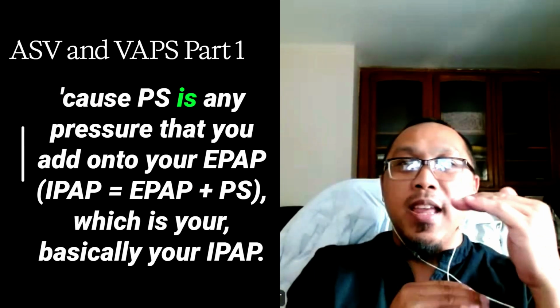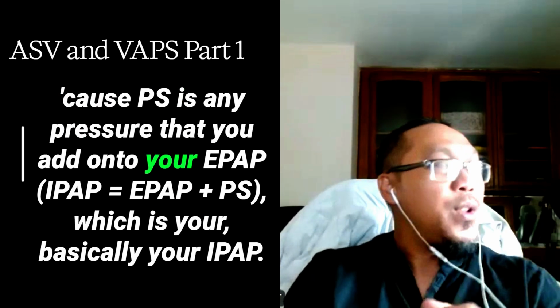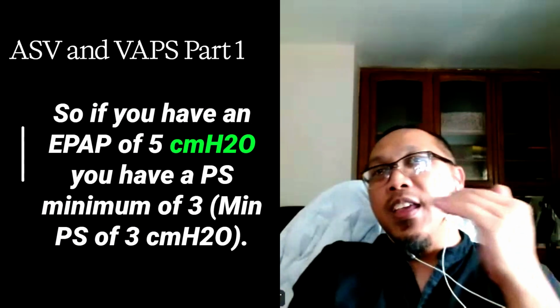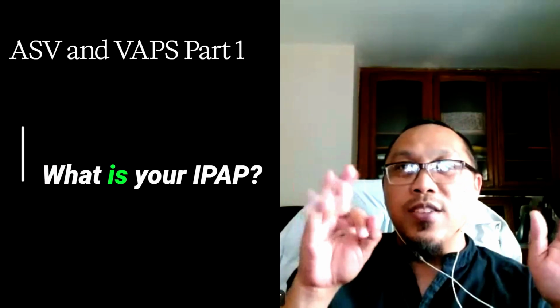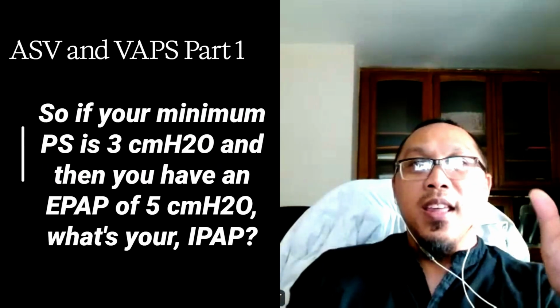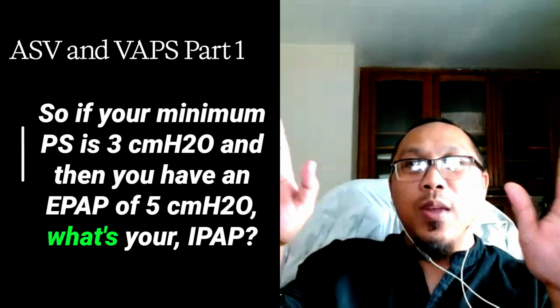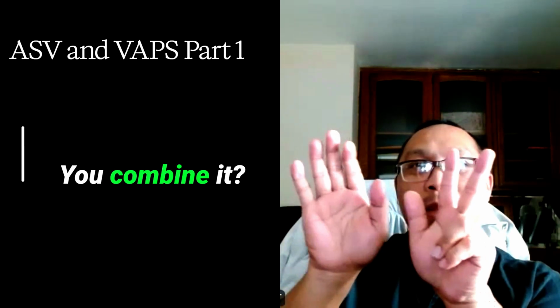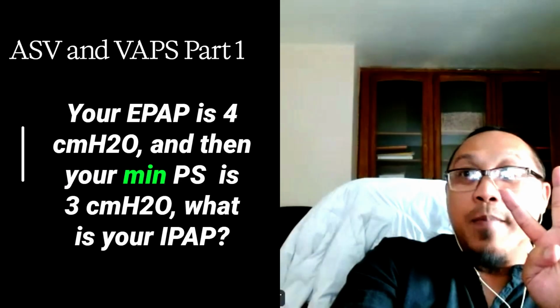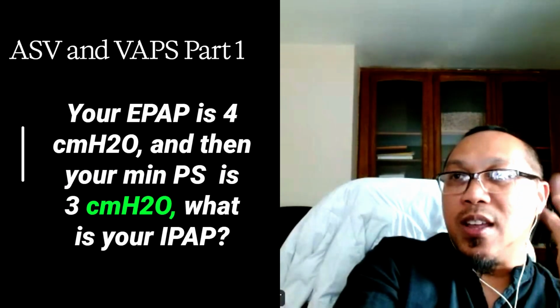Because pressure support is any pressure that you add on to your EPAP, which is basically your IPAP. So if you have an EPAP of 5, you have a pressure support minimum of 3. What is your IPAP? You combine it. 8. Okay. Your EPAP is 4, and then your minimum pressure support is 3, what is your IPAP? 7. Correct? You just add them.